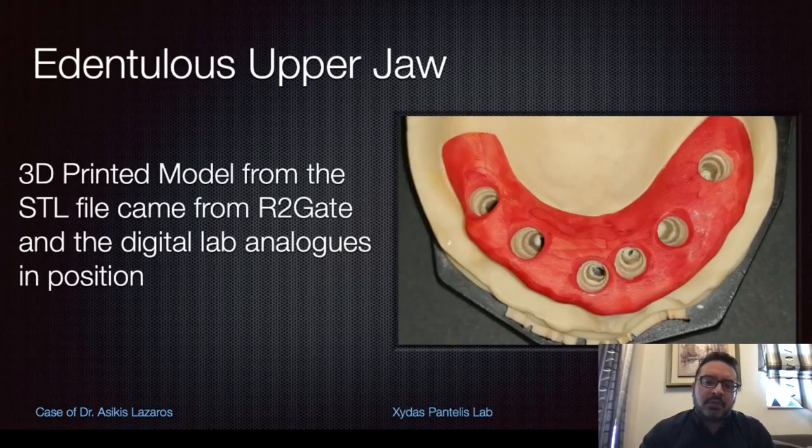Because this was a very good case, and we have the time to do a lot of experimentation on the 3D printing model, you can see that we also used an extra overlay for the soft tissue, so as to choose the correct abutments. The dentist, Dr. Asikis, wanted to try the Octa system, so we have to choose the Octa according to the soft tissue height.